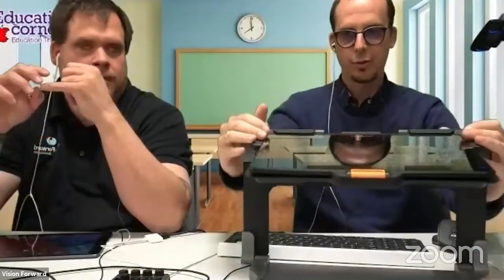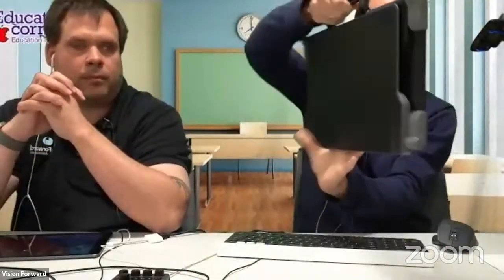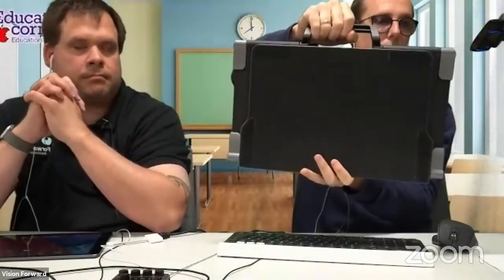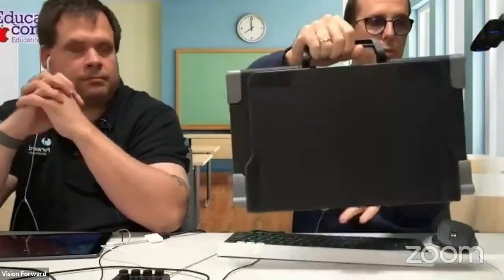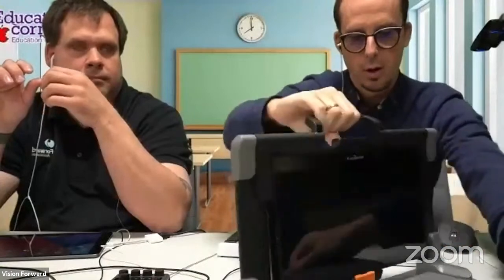Now, one of the nice things about this device is it folds away and it becomes almost like a briefcase type of thing. Protects the screen. Yeah, so it protects the screen. It does have a carry bag with it as well. But yes, when you fold it, it will protect the screen, and it's light enough to easily carry in between classes. So that's a really nice feature.